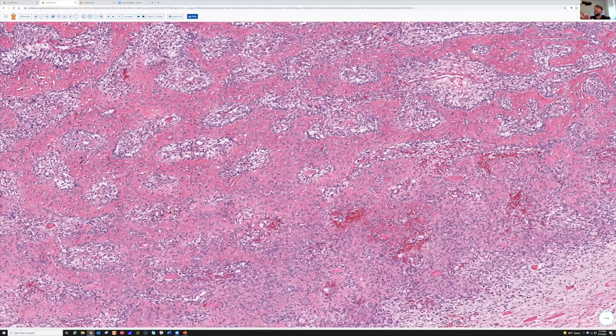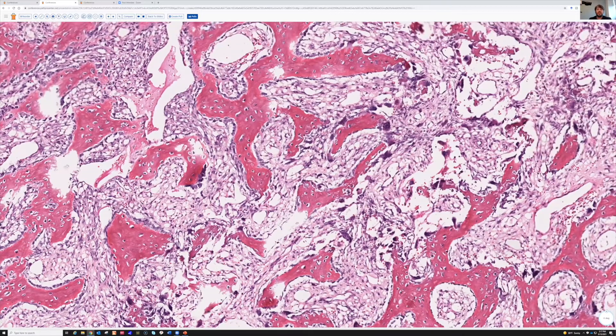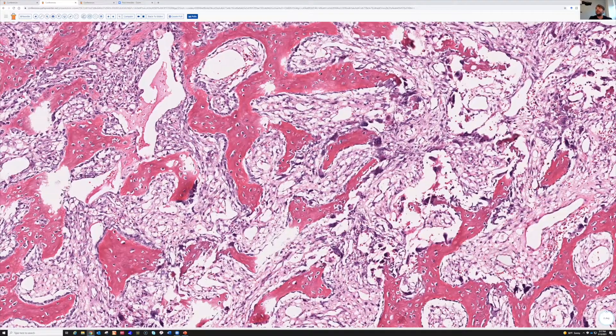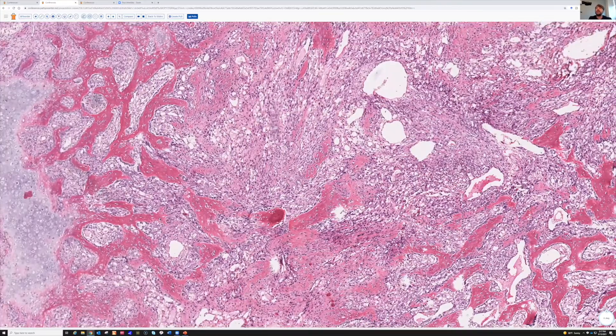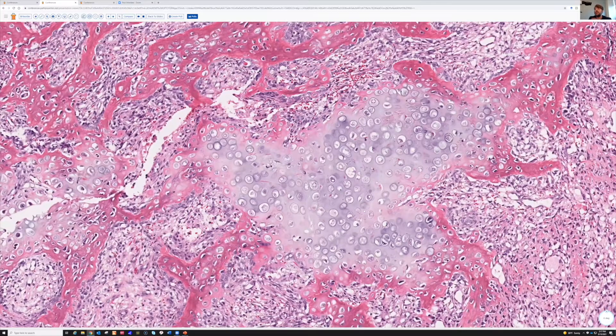There are also some scattered giant cells. Anytime you've got bone formation or bone breakdown, you're going to get osteoclasts that come and hang out. In the center, there's a cellular spindled area with a loose edematous background. And then - look at that crazy island of cartilage with huge nuclei.